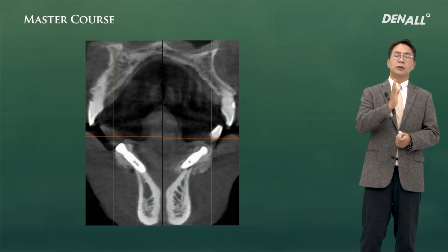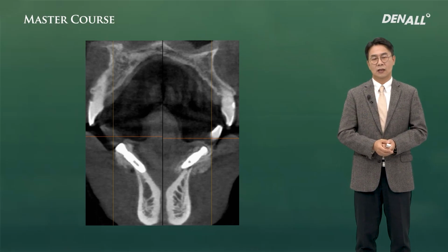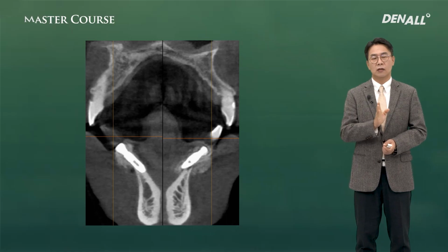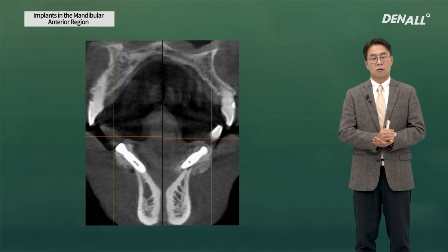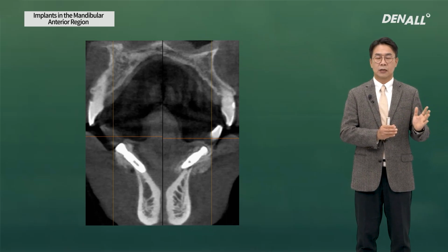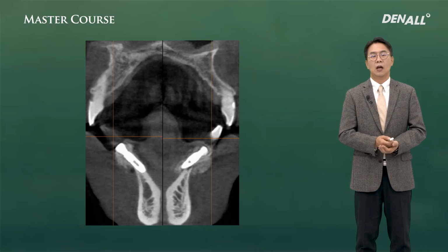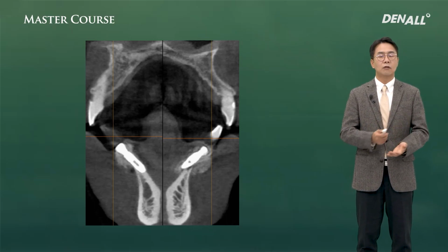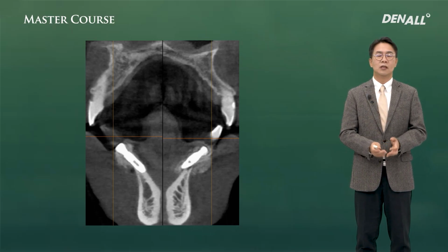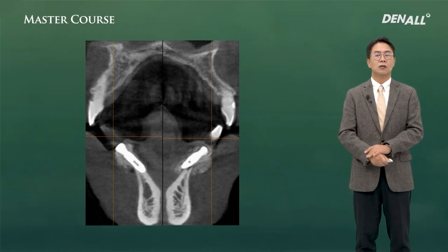We took great care. However, it is very much inclined lingually when we wanted to place the implants, but it was a situation where the implant would be inclined labially. Number 41 was okay, but 31, the inclination was not good. How can we prevent that from happening? This can happen anytime. So we need to reduce the error rate of making this mistake.